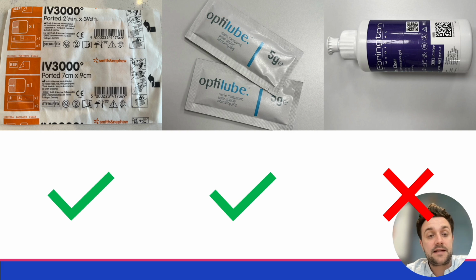So keeping things clean, okay? We do not use this ultrasound jelly, which you may have seen hanging around some ultrasound probes. It is not going to be clean. We use specific ultrasound jelly, or jelly that we would use for PR examinations, so sterile lubrication. As long as it says sterile on it, it should be fine.